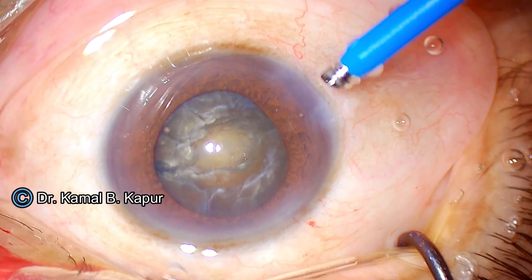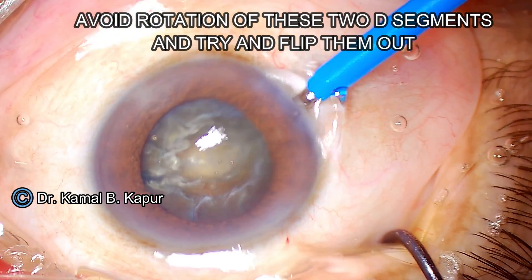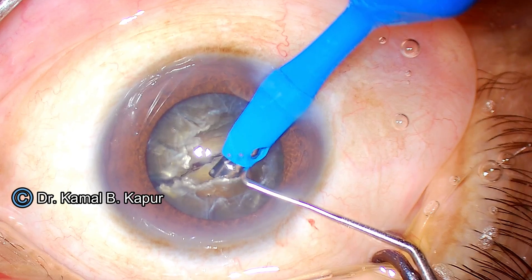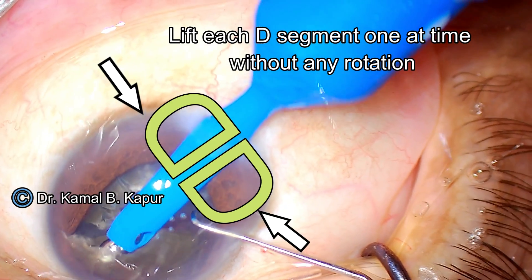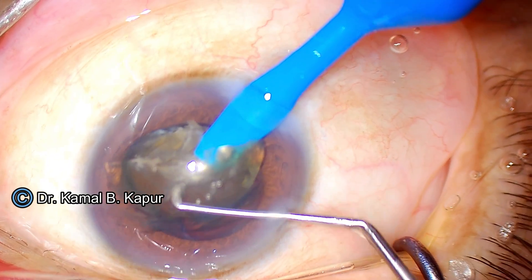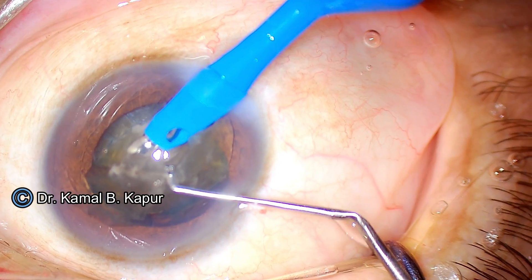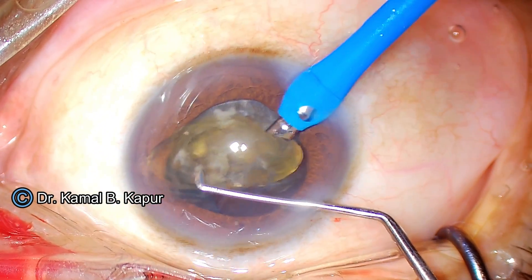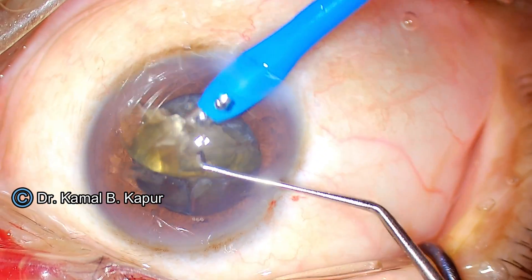Now with two D segments present, we go on a low phaco power mode with the bevel tilted toward one side of the D segment. We embed at the junction of two-thirds and one-third of the D segment and slowly pull it out along the oval capsular axis. This is where the oval capsular axis has really helped us. This movement must be done without rotation, because rotating the D segments could cause the pre-existing posterior capsular opening to extend and the hard nucleus could drop into the vitreous.